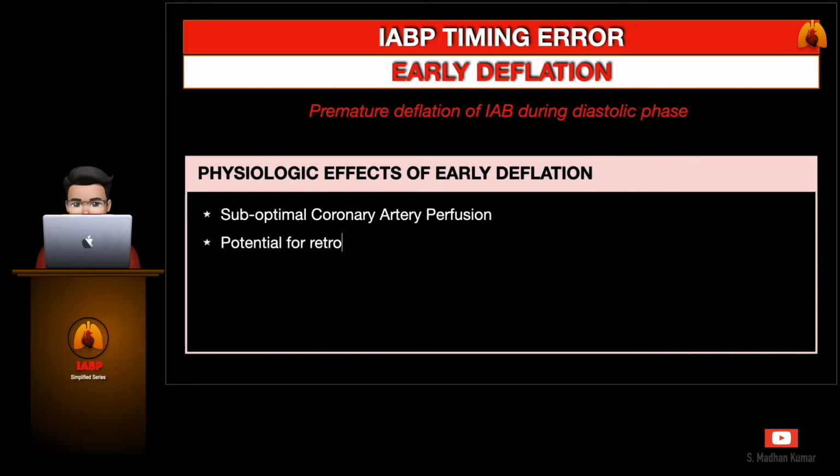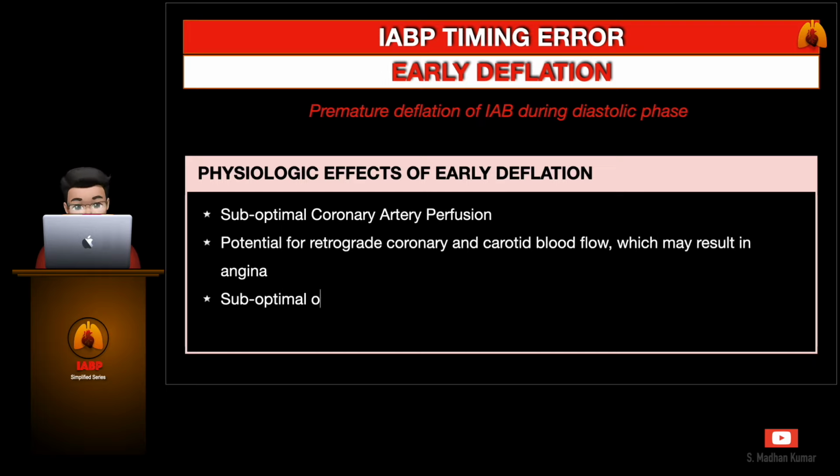The physiologic effects of early deflation are suboptimal coronary artery perfusion, potential for retrograde coronary and carotid blood flow which may result in angina, suboptimal or no afterload reduction, increased myocardial oxygen demand.